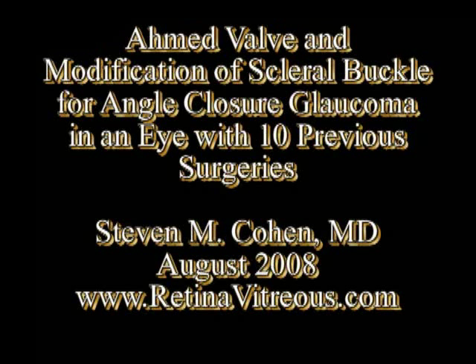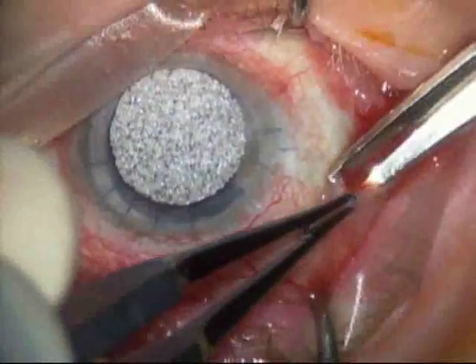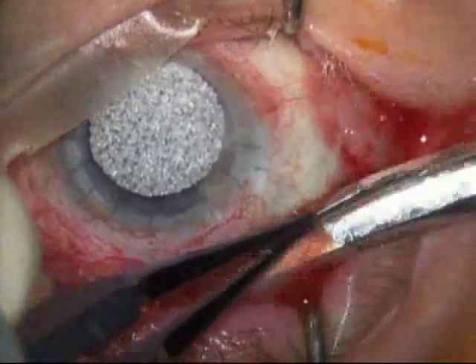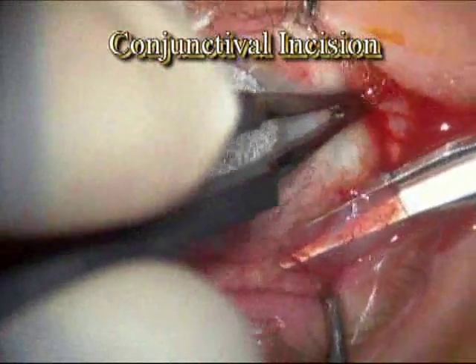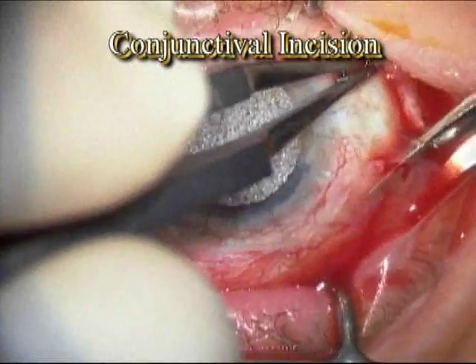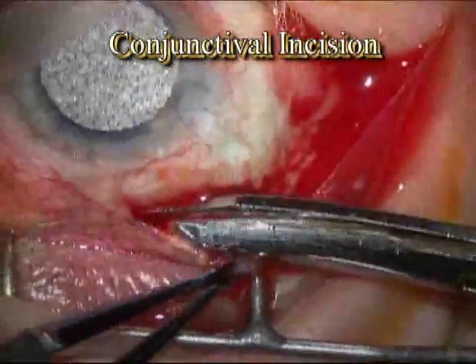I'm Dr. Steven Cohen and this is a video of a patient having an Ahmed valve placed for angle closure glaucoma. This patient has had 10 previous eye surgeries including a scleral buckle for a retinal detachment. Because of all the previous surgeries, the conjunctival dissection which is what you're seeing here is both difficult and important. It's important to preserve as much conjunctiva as possible to cover the Ahmed valve at the end of the surgery.